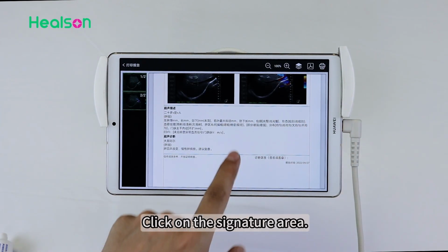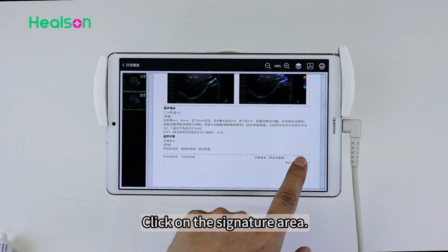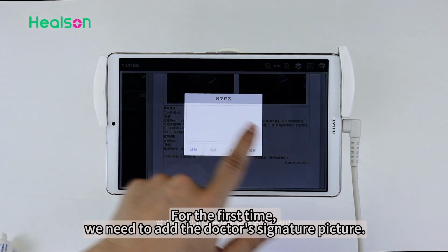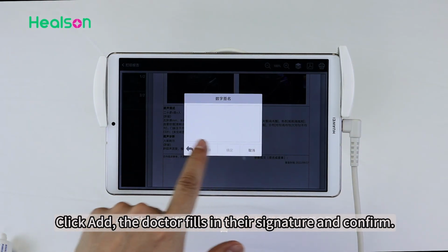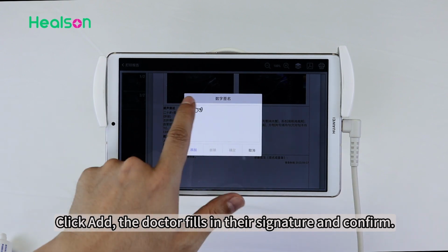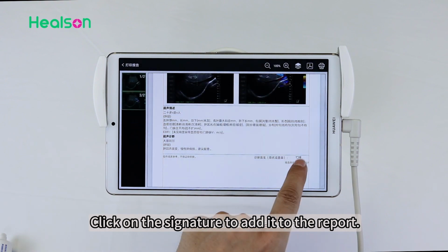Click on the signature area. For the first time, we need to add the doctor's signature picture. Click Add. The doctor fills in their signature and confirm. Click on the signature to add it to the report.